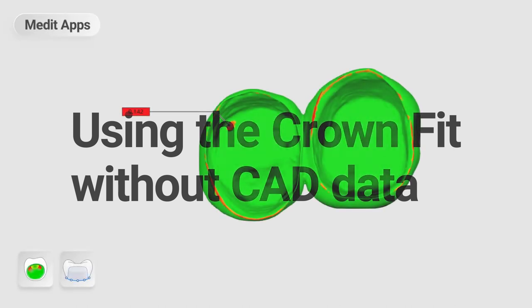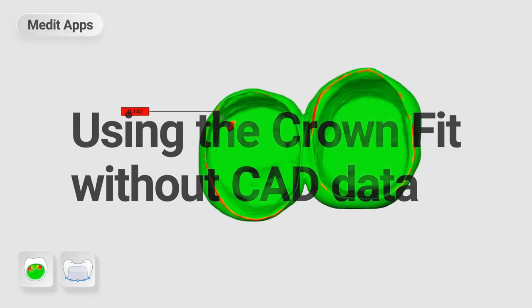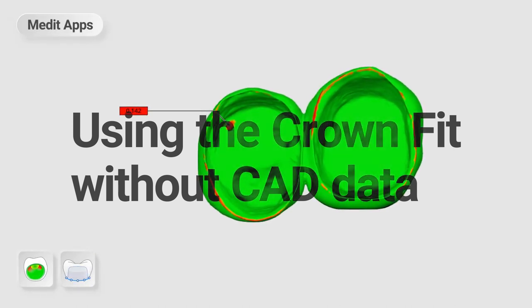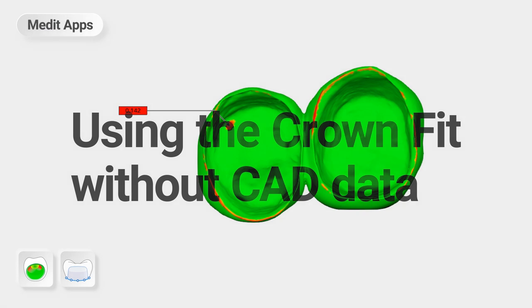This is a quick guide on how to use the crown fit without CAD data. Note, this workflow only can be performed when the margins are pre-drawn even before you place an order for prosthetic work.